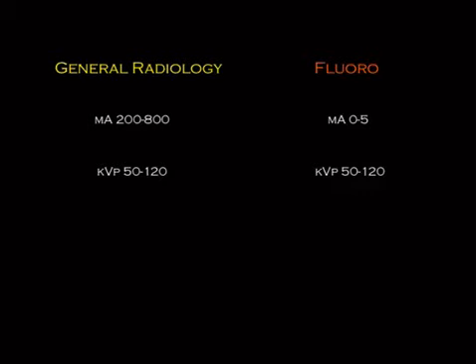So think about a spot like a conventional X-ray. A frame shot or a last image hold is different than that. That's like you're just telling the computer to hold the last image that was shown on the fluoro screen.